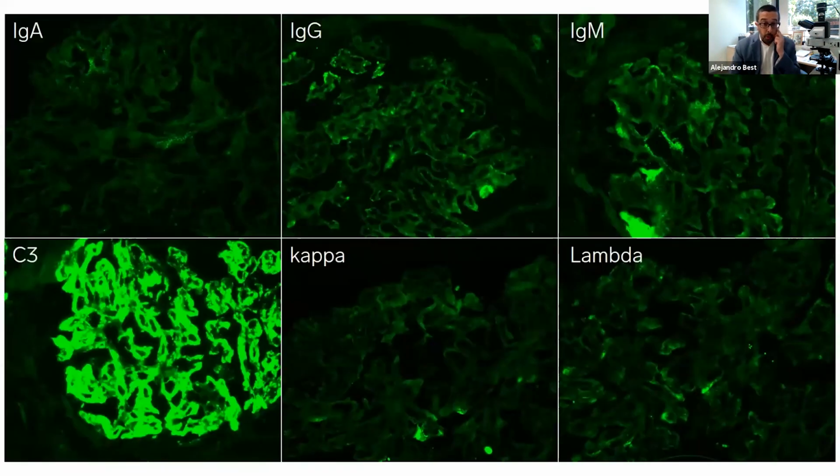So even though we keep saying that it can be C3 only, it doesn't have to be C3 only. As long as it's C3 dominant or predominant, it's good enough to make a diagnosis. And the strict definition is you need to have 2 orders of magnitude C3 above any of the other immunoreactants. So let's say you can have a 1+ IgM and a 3+ C3. Yeah, that's meeting criteria for C3. That's okay. So a little bit of immune complex deposits, it's okay. In fact, if you have more deposits, it potentially could still be C3G.